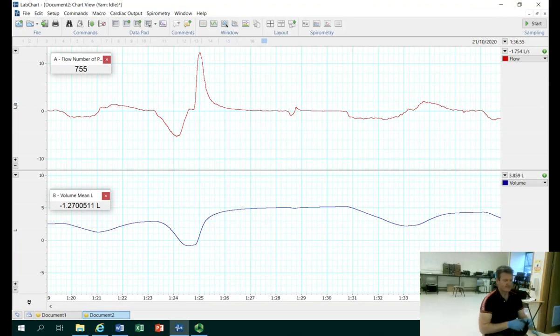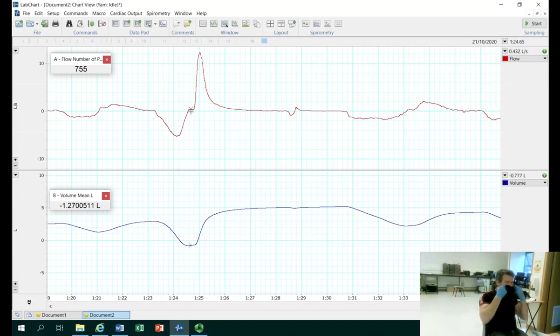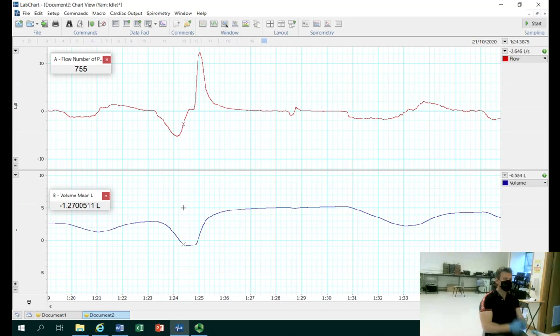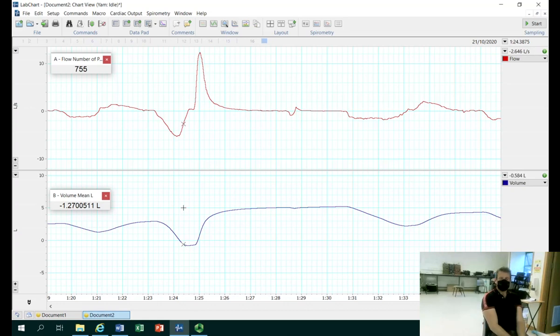You can see here we have two channels. We are measuring the flow rate of air and we are also measuring the lung volume. What we want to do is calculate a normal tidal volume, and then calculate two other factors: the inspiratory reserve volume and the expiratory reserve volume.